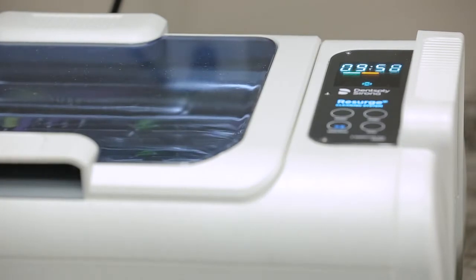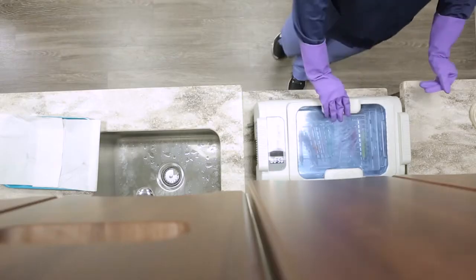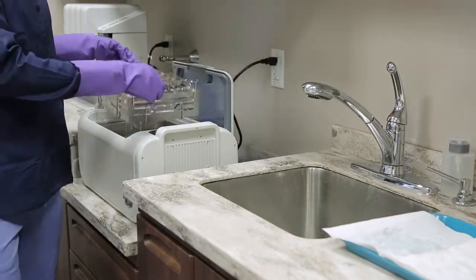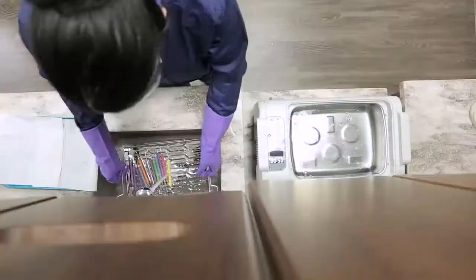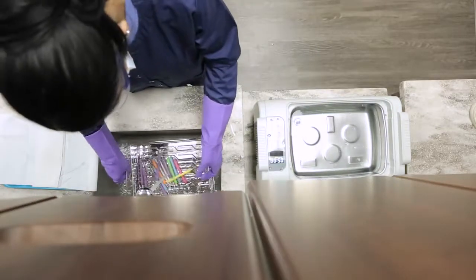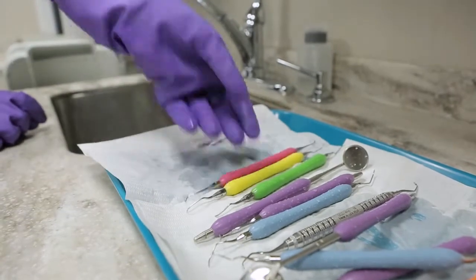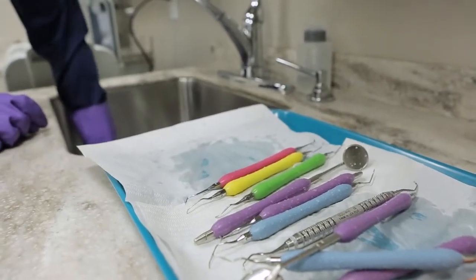Once the cycle ends, remove the lid and place it in the convenient holder on the back of the unit. Lift up the universal rack and allow excess liquid to drain off the instruments. Rinse the instruments to remove any residual instrument cleaner, then lay on a towel to dry in preparation for autoclaving.